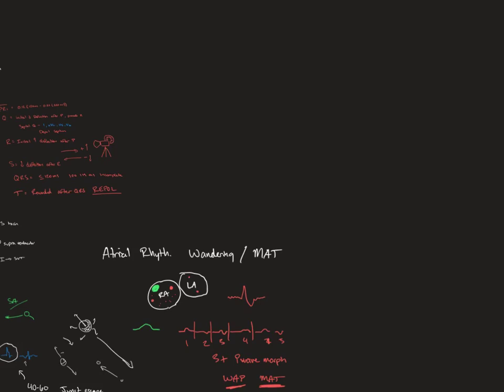You can have a sinus pause, right? You can have your P wave, your QRS, everything's great. Let's substantiate this claim first. Let's say this is a normal rhythm. And then a pretty decent pause happens, and then you have no P wave, but a junctional rhythm.